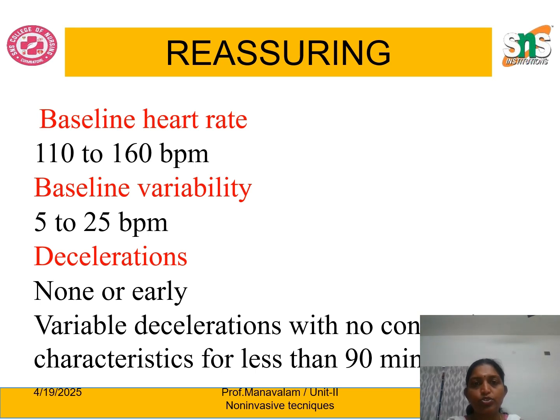As I already said, reassuring indicates a healthy fetus. A healthy fetus lies in this category. A healthy fetus must have a baseline fetal heart rate between 110 and 160 beats per minute, and baseline variability of 5 to 25 beats per minute. There should be no type of deceleration, but sometimes early deceleration is acceptable.